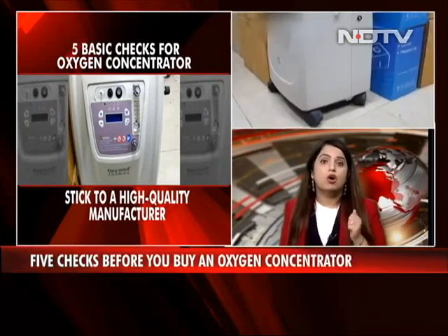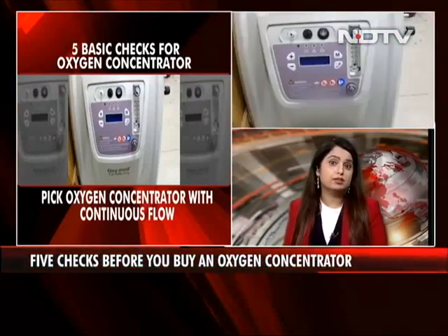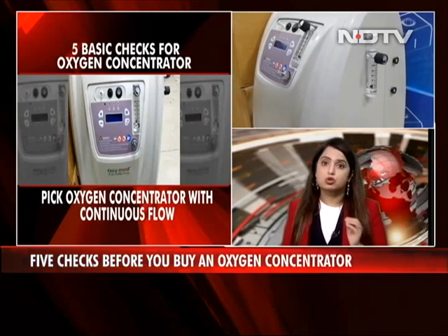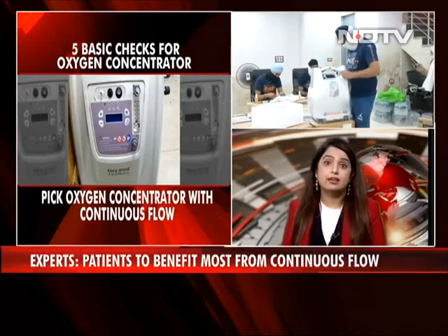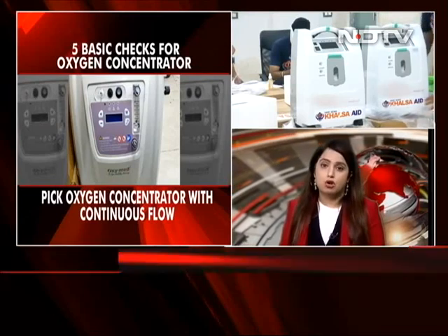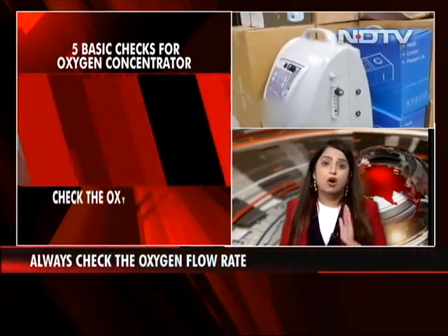First, pick the oxygen concentrator with continuous flow. Not all oxygen concentrators are built the same. Available in both continuous flow and pulse dose variants, COVID patients will benefit most from a continuous flow oxygen concentrator. This guarantees a fixed flow of oxygen every minute compared to a pulse dose concentrator that depends on breathing patterns.